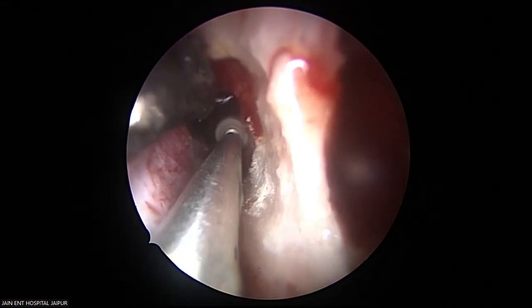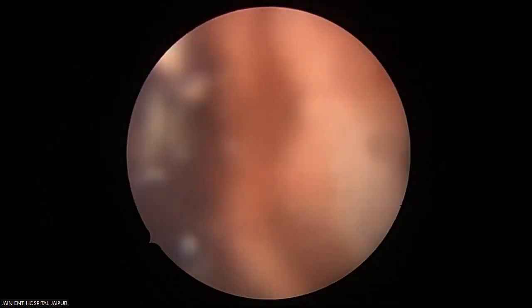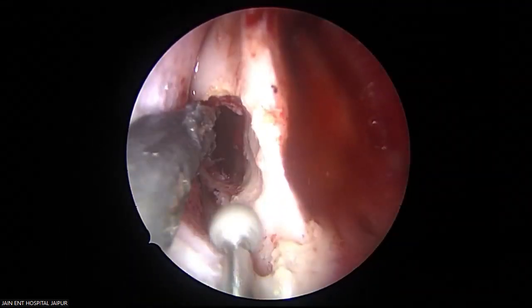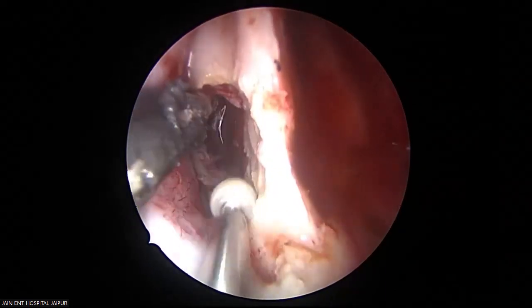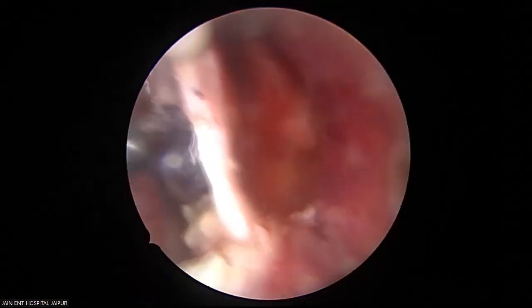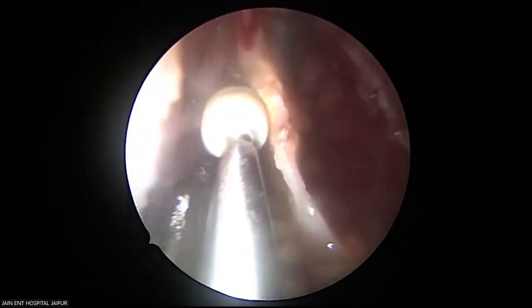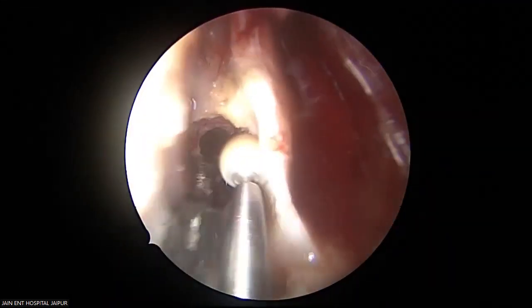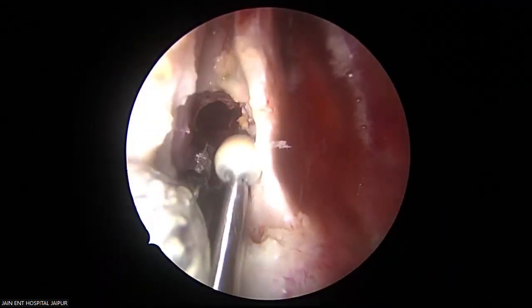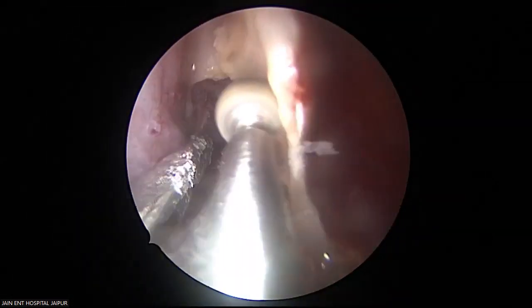This is our principal exposure, the paramedian exposure to reach the paramedian skull base. This you can do fast with the chisel and hammer as well, but that cannot be so precise.